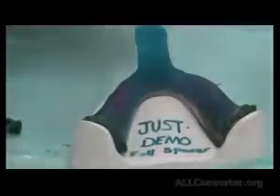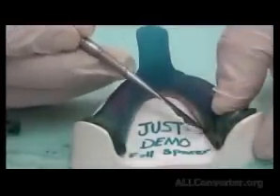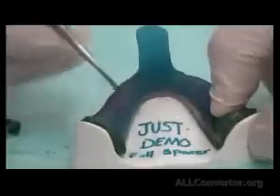Swallowing will activate this part, which is the deepest part of the lingual pouch. Moving the tongue to the left and right and swallowing will activate this anterior part. So if the patient does these, I would have recorded the lingual pouch perfectly.